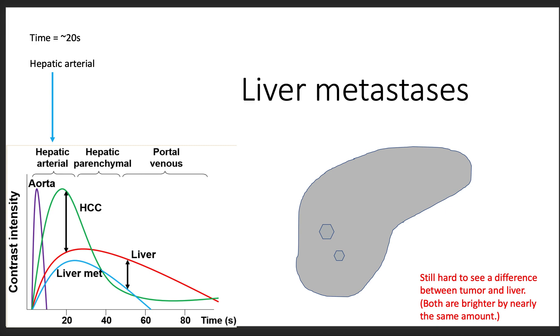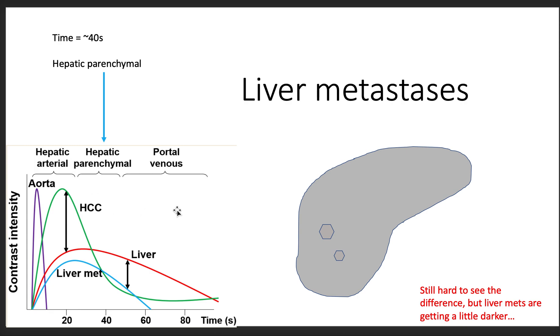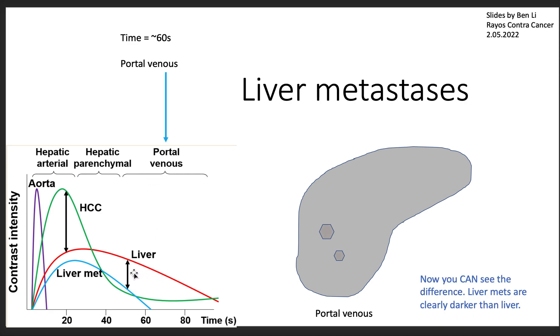Moving on, between the hepatic arterial phase and the venous phase, the liver metastases are starting to get darker, whereas the liver is staying bright. When we get to the portal venous phase, look at this difference: the liver metastases in the blue line is dark, and the liver is still relatively bright. Looking at the image, you can now distinguish the metastases compared to the liver — the liver metastases are clearly darker than the liver and you can see it.